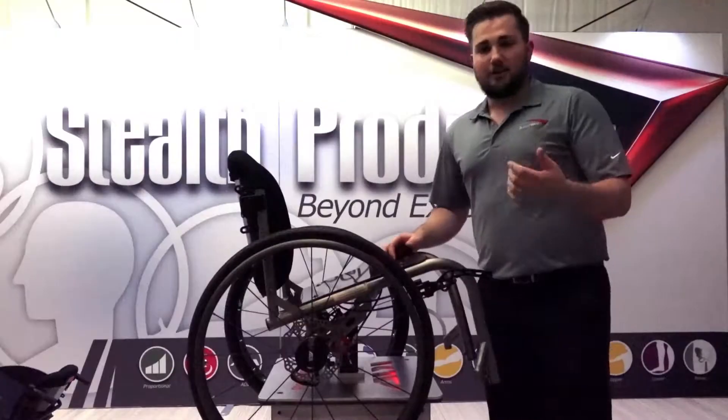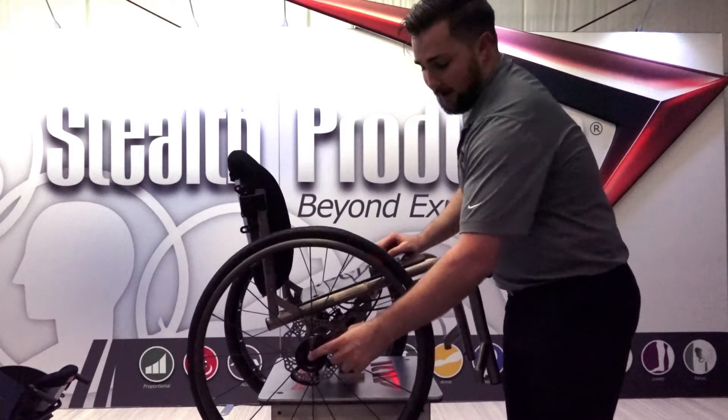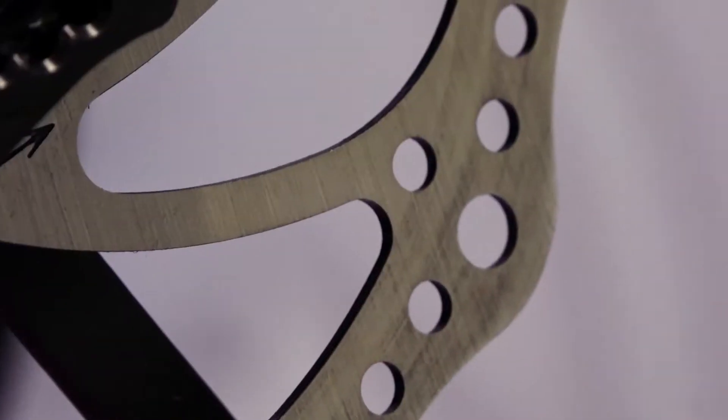The disc brake system was designed by Todd Harbroder of ADI. He's a former owner of ADI and now a senior engineer at Stealth. He designed it using mountain bike brake parts, so the disc and calipers are both robust and can handle whatever forces any end user may exert into the system.